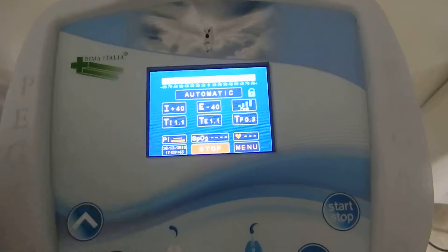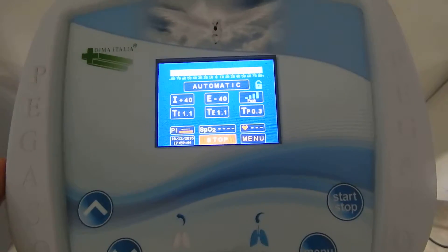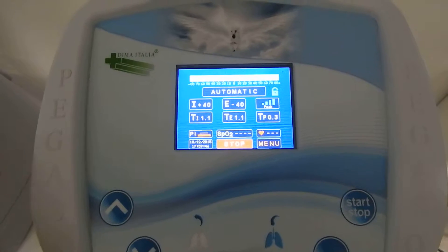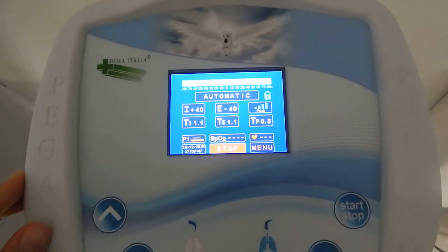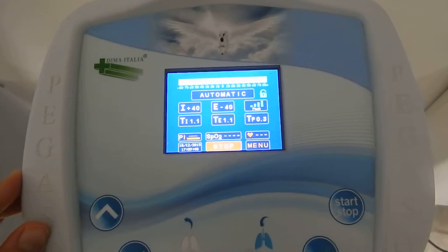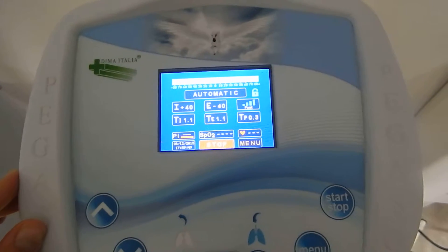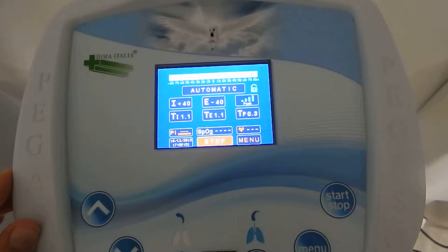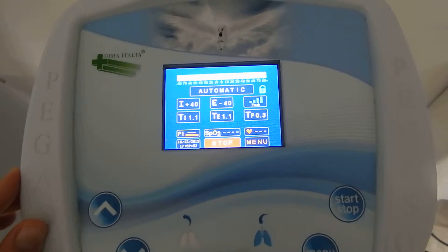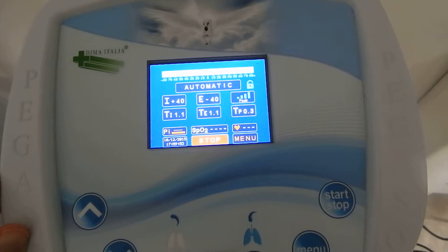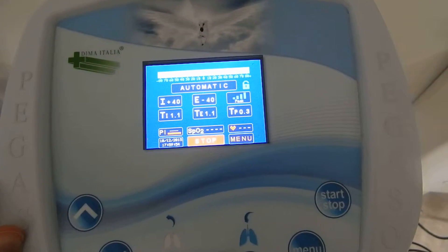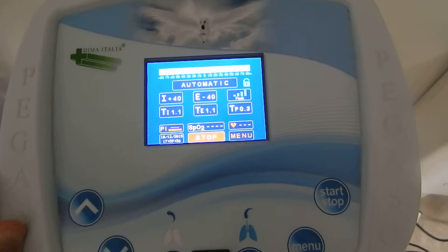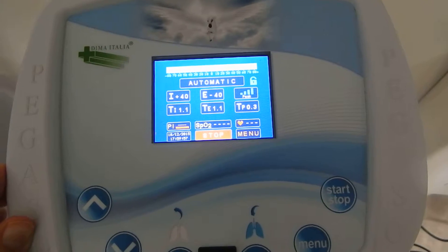This is followed by a null pause. The three application times — TI, TE, and TP — will be set up and then applied for each cycle by the operator.